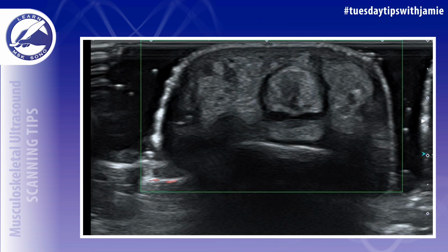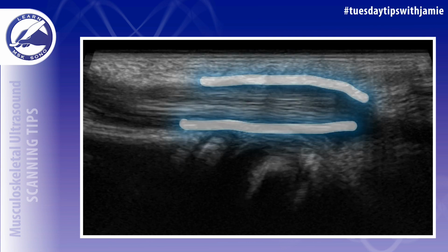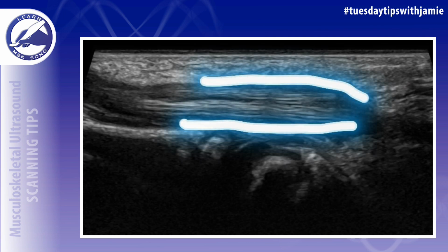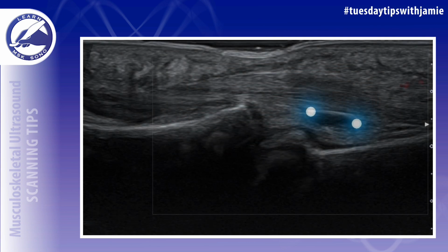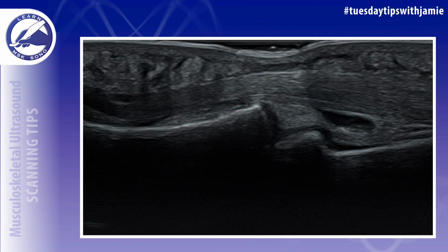Tenosynovitis is considered inflammation of the synovial membrane surrounding a tendon as a result of trauma, repetitive strain, or disease. The synovial membrane that surrounds the tendon is barely noticeable unless there's fluid present. It's important to scan the area of interest in two planes before deciding the diagnosis.